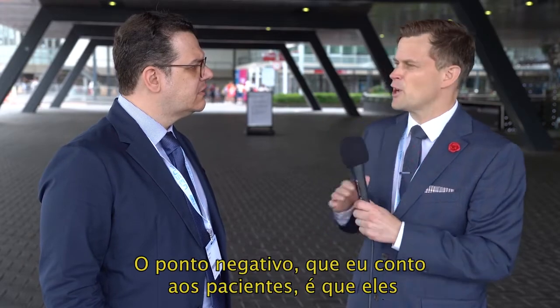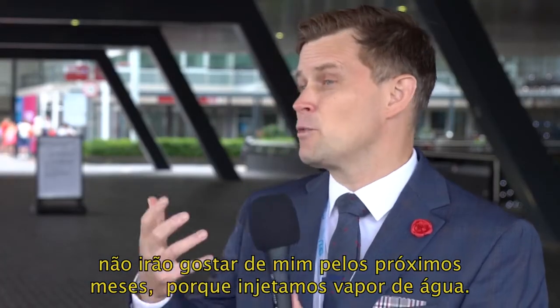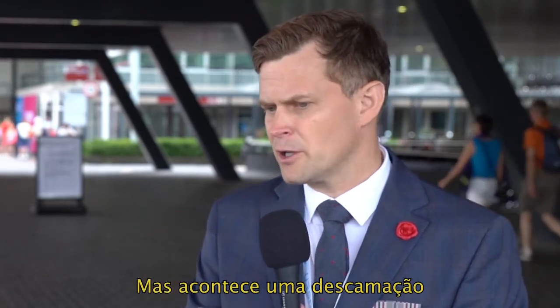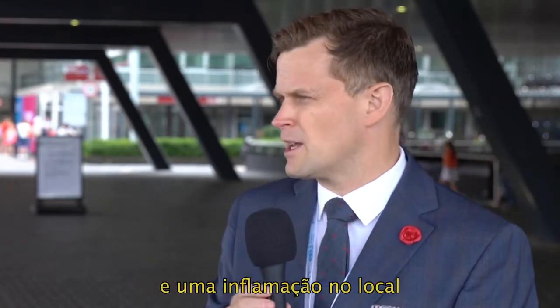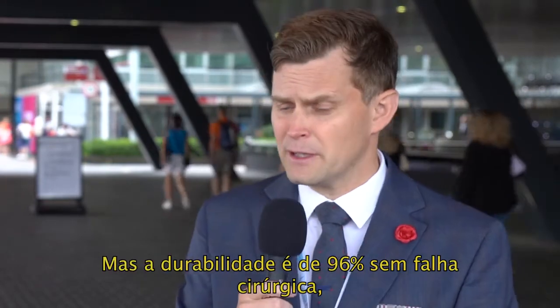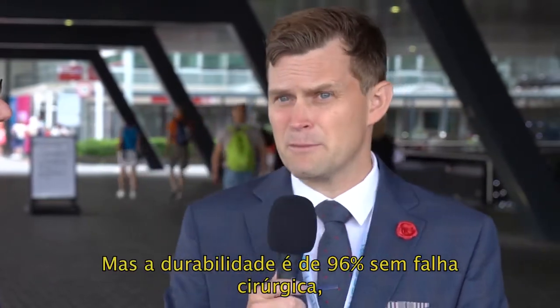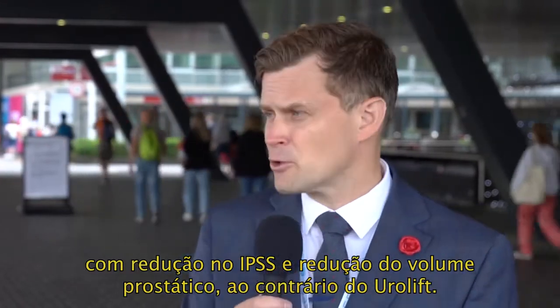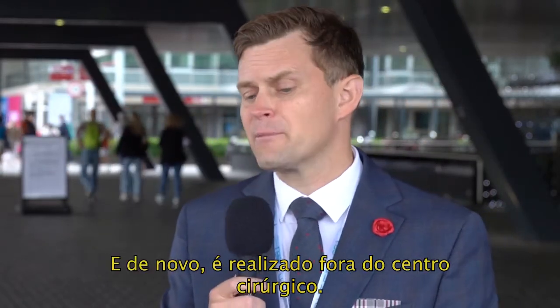And patients, the downside is I tell patients, you're not going to like me for the next month because we've injected some steam, it's very quick, but there's that sloughing that's going to occur, and there is the inflammation, and that can take a couple of months, 3 months to get your good results, but the durability is 96% outcomes without surgical failure and reductions significant in IPSS, and it shrinks the prostate, unlike UroLift. And again, it takes time away from your OR.